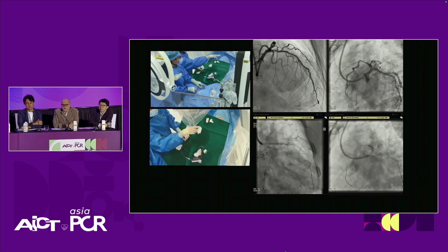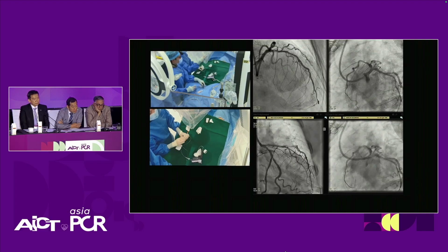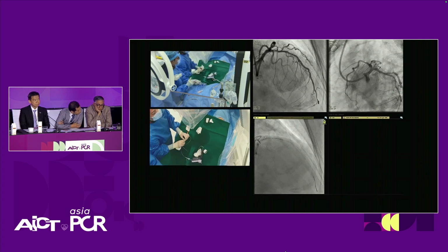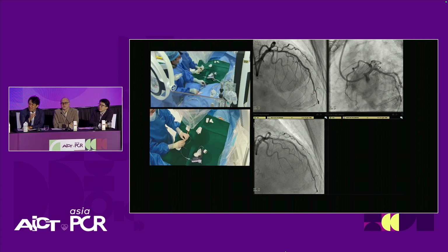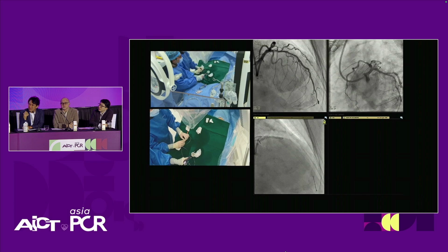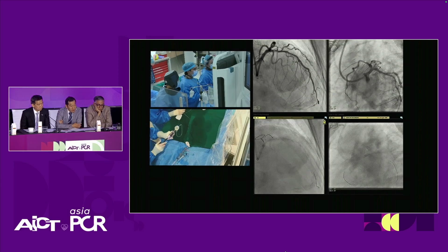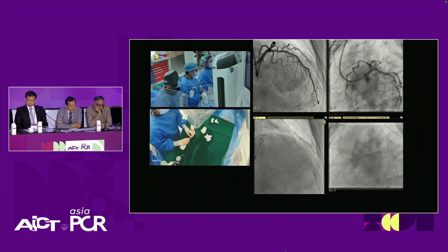So Mark, it looks like it's a crossover stenting strategy. Dr. Tori, would you cross over stent, or would you aim for the ostium of the LAD? For this case, there is a very sheet calcification at the ostial LAD. Maybe we can finish our procedure with ostial stenting. But this patient was 54 years old, right? And bleeding risk is not that much, so maybe we can cross over too. But I would go ostial stenting. More than one way to get a good result.